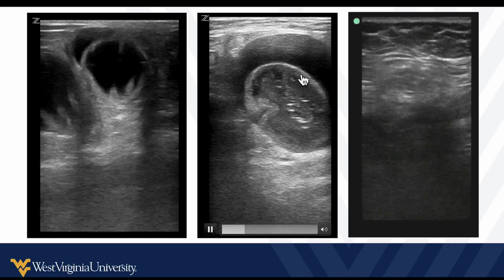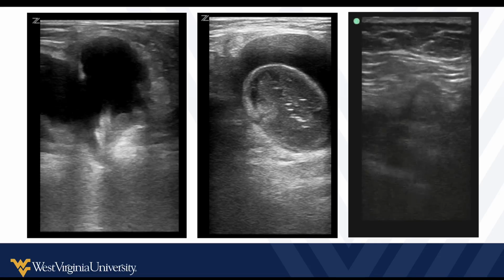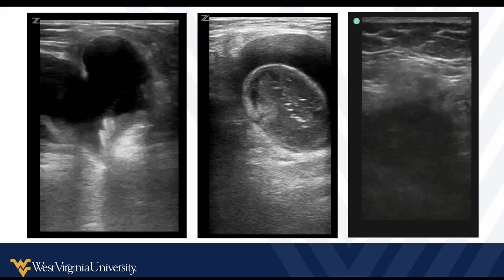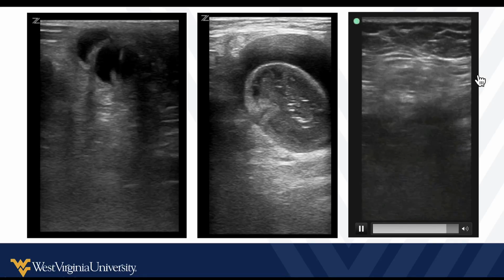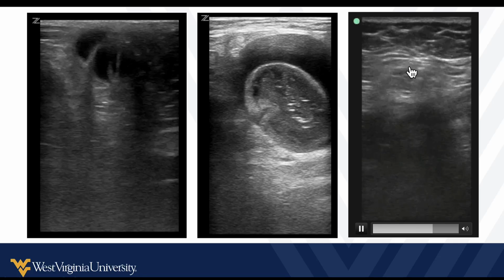So this is another patient who says, I have a lump here and it hurts. You can look and see what it looks like. And these are both clear bowel-containing hernias. Now, are they reducible or not? Are they incarcerated? That takes a little more evaluation. And this is that same one we saw earlier. This is very subtle omental fat pushing through. You see the borders of the peritoneum and then omental fat just pushing through that little defect.